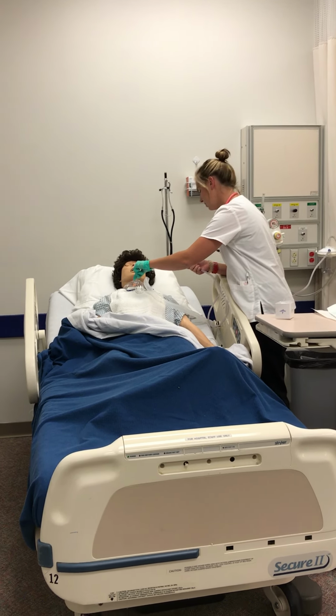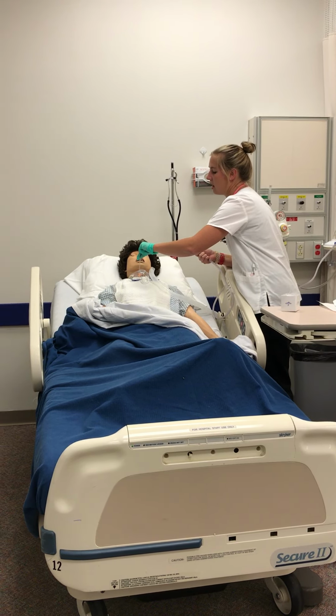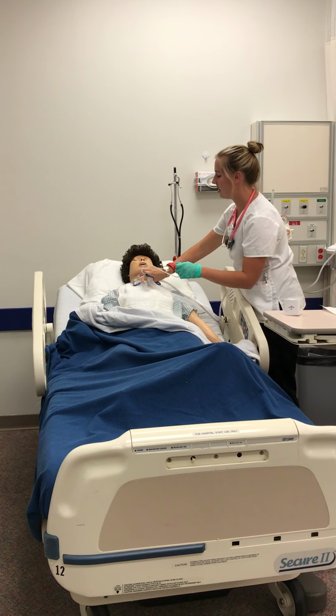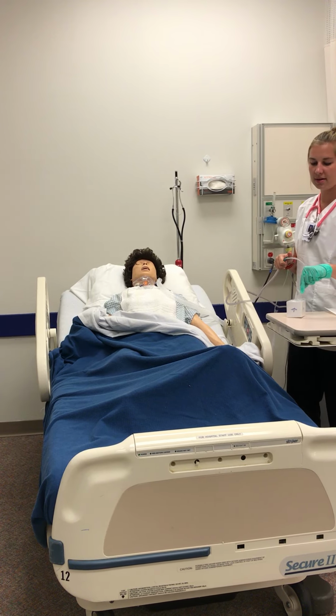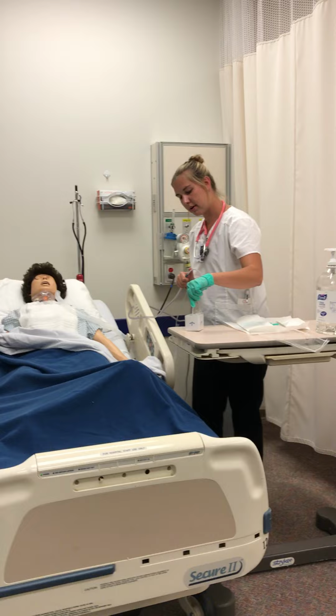Feeling the resistance, and then suctioning intermittently as I twirl the catheter out. Placing oxygen back. And suctioning the saline solution to clear away the rest of that mucus.